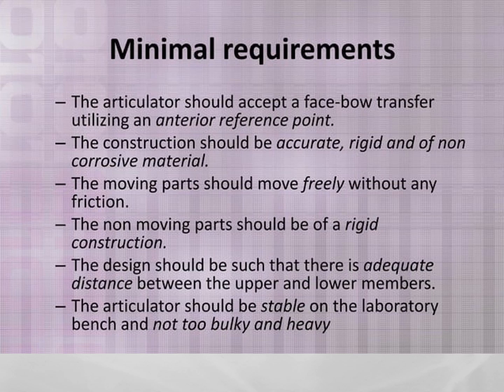The moving parts should move freely without any friction. The non-moving parts should be rigid in construction. The design should be such that there is adequate distance between the upper and the lower members. The articulator should be stable on the laboratory bench and it should not be too bulky and heavy.